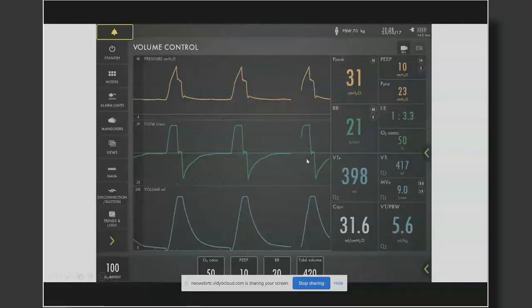So just to give you an idea of what it looks like on a ventilator, this is an example of a Servo-U ventilator. And what's interesting, the Servo-U, when you have the patient in volume assist control or any mode for that matter, plateau pressure actually doesn't show on the screen at all unless you have set a pause. So when you set a pause of 0.2 seconds, this monitored value shows up all the time. And now, if my flow is 60 liters per minute, which looks like it was here, the peak here is 70, so we're at 60 liters per minute of flow.